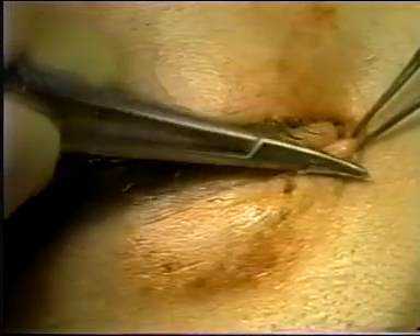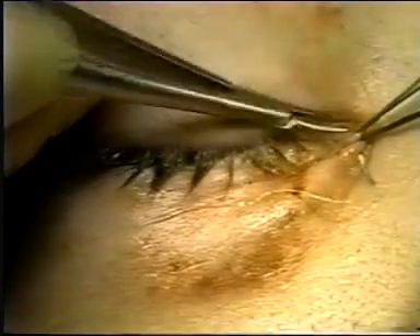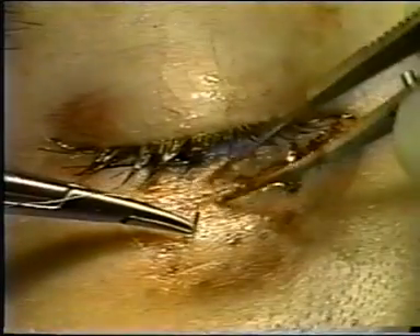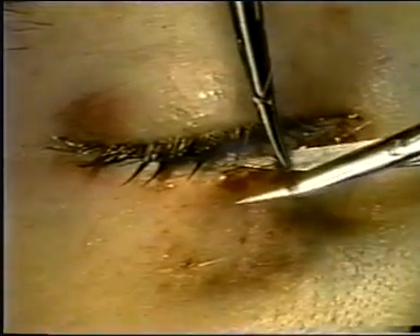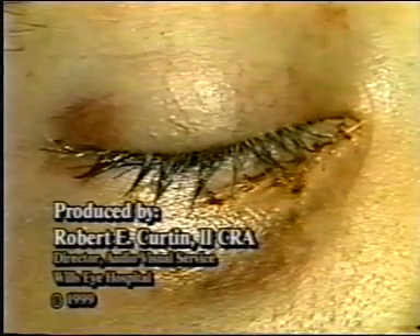The skin can be closed with an absorbable suture such as a 6-0 plain suture, which will dissolve within five to seven days. All associated lacerations should be repaired at the same time. An antibiotic steroid ointment combination is used postoperatively in addition to ice packs to reduce swelling.